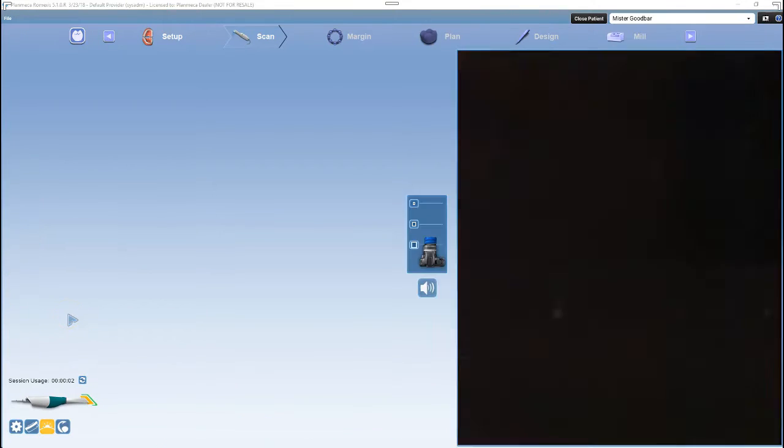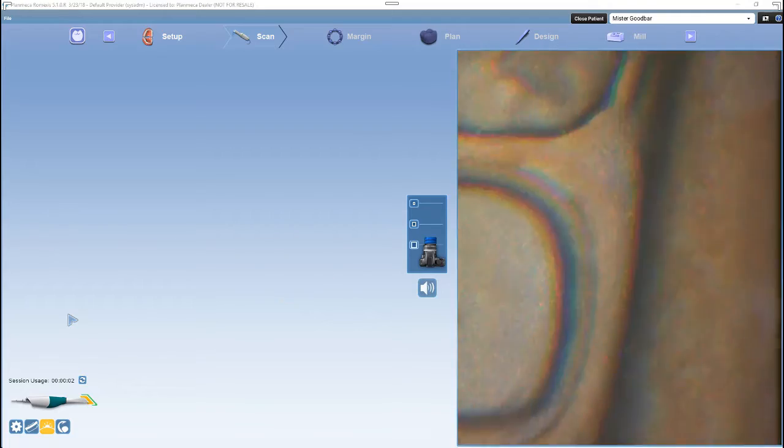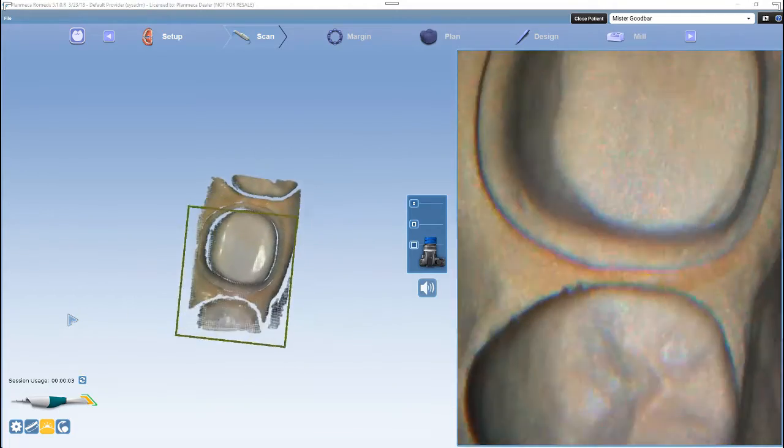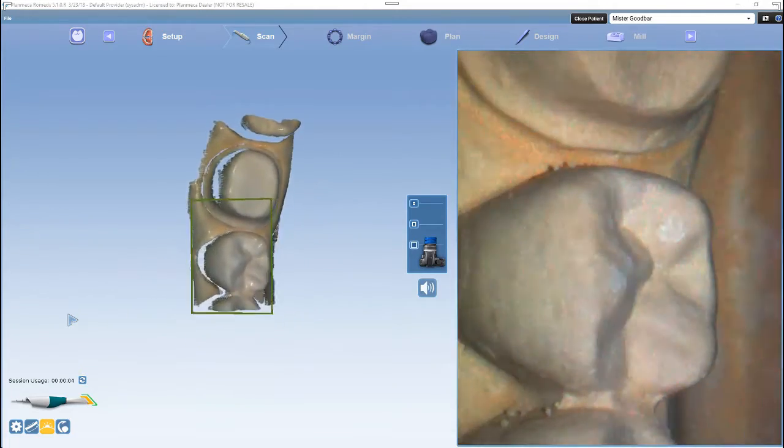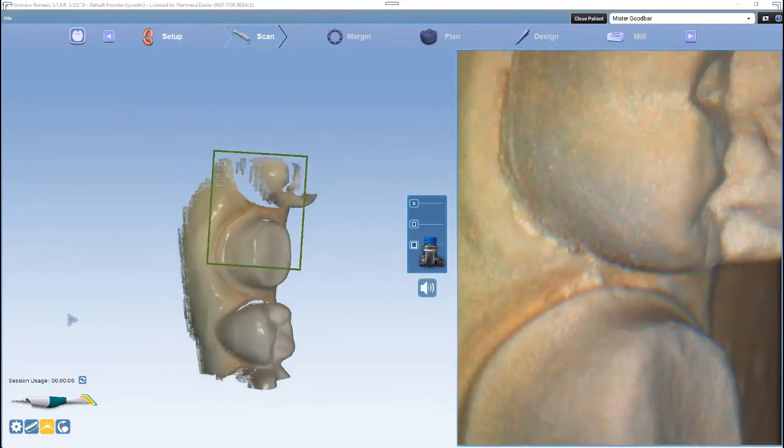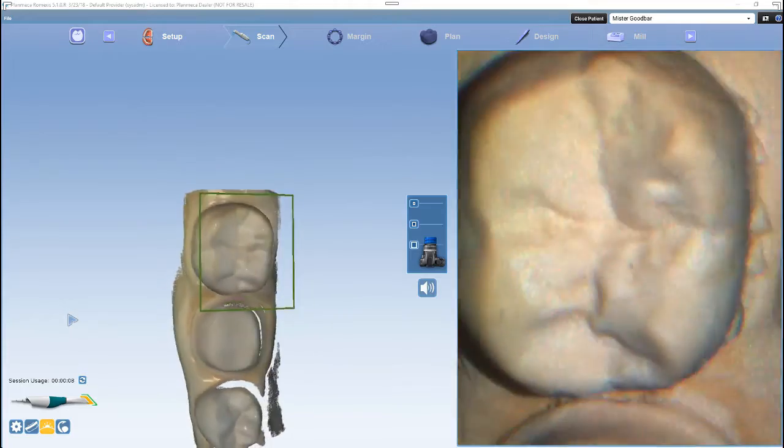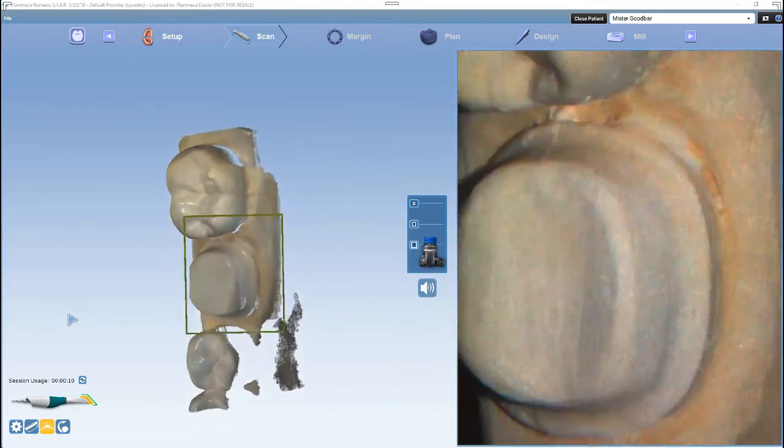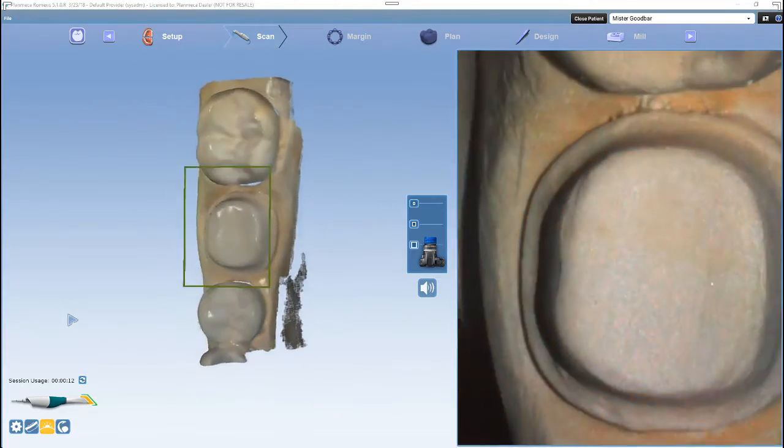To activate the scanner, push and release the top button. To deactivate, push and release the top button. The spacebar will also activate or deactivate with a push and release.